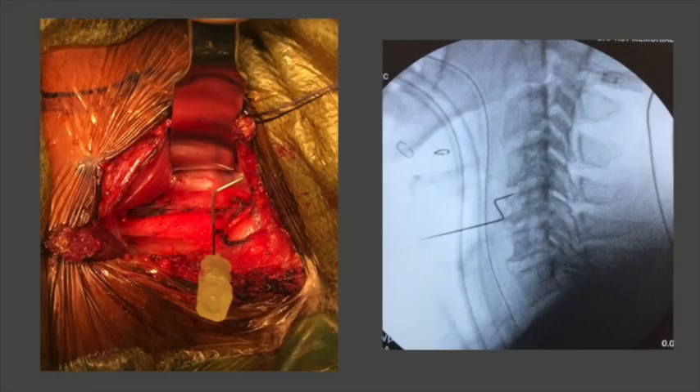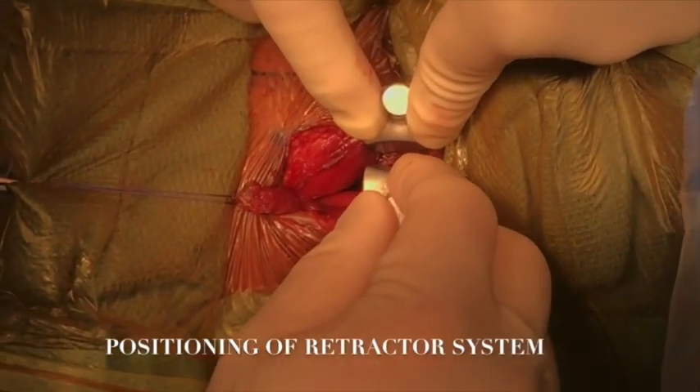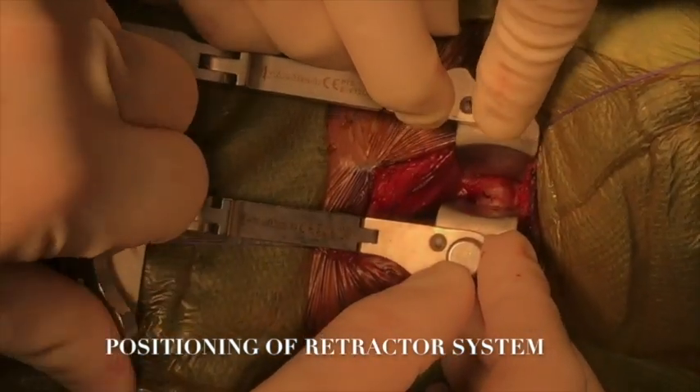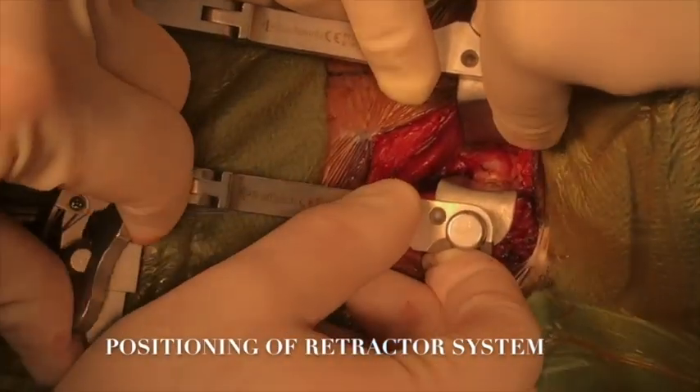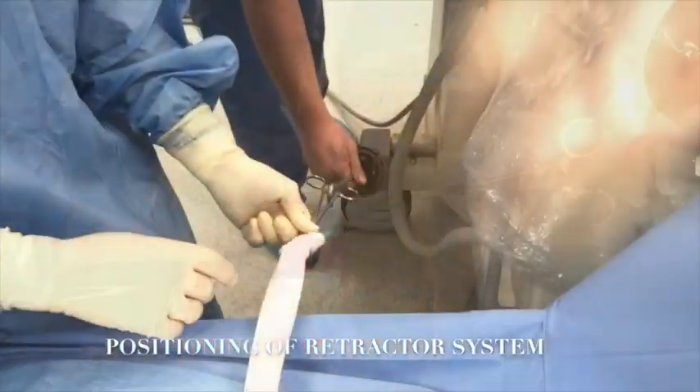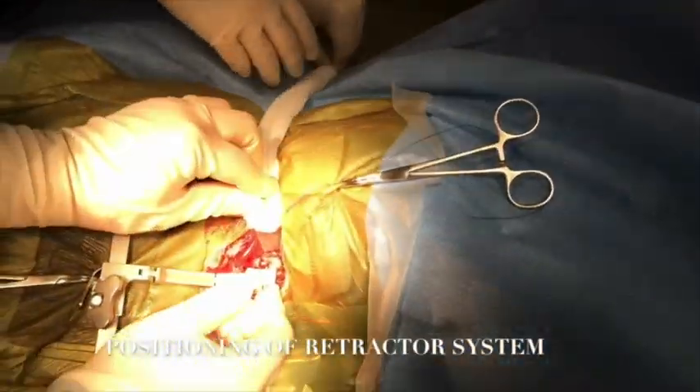A bent needle was used to identify the highest level planned for surgery at C4-5, demonstrated on the intraoperative lateral C-spine x-ray. Following this, the lateral retractor was placed in position at C5-6 at the center of the exposure, and then the Curlex was placed on the right retractor blade. An additional two pounds of weight was placed on it to prevent the right-sided retractor from sliding.